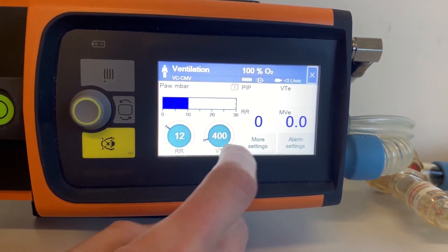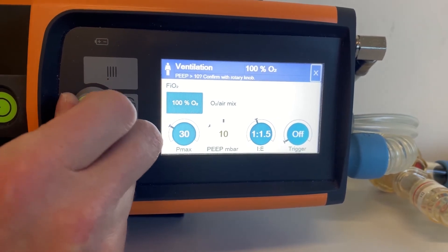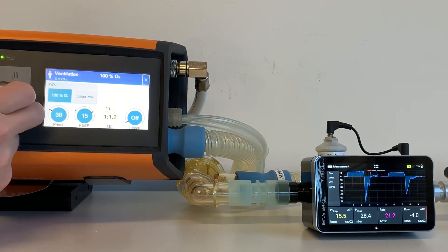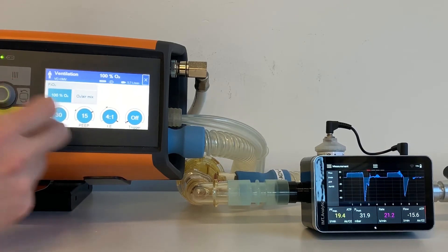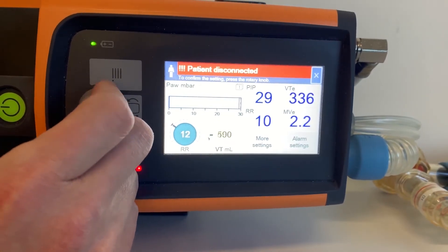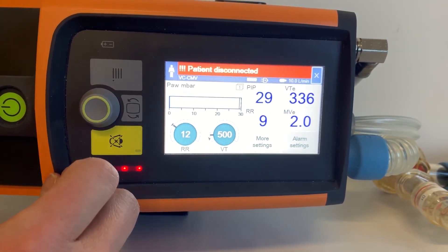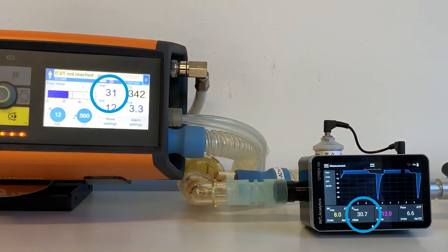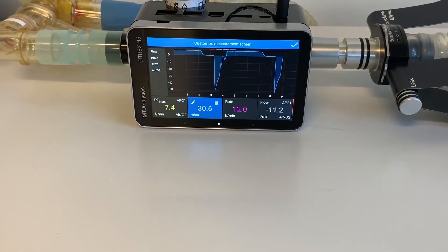Start Ventilation and select More Settings. Set PEEP to 15 millibar. Set IE to 4 to 1. Then set VT to 500 milliliters. Compare the displayed PIP value and the PEEP display on the Citrex. In our case, OxyLog shows 31 and Citrex around 30.7. The measured value may deviate by a maximum of 3 millibar.